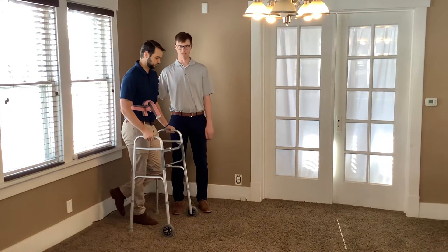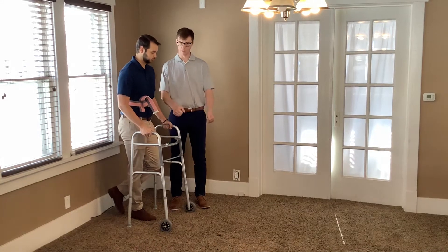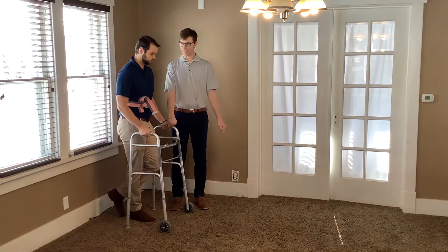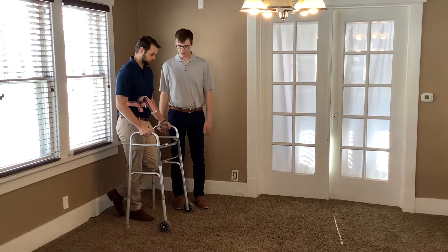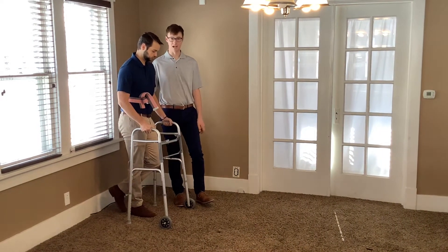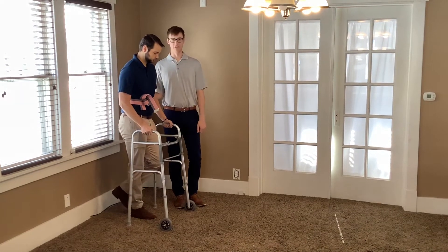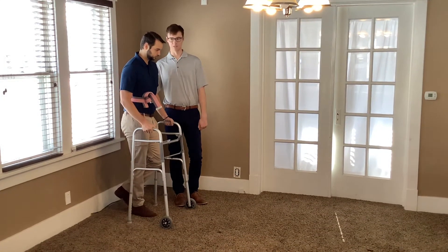Before we go, I'm going to give the instructions: roll the walker forward, push your weight through your hands and onto those hand rests, then move the affected leg forward. It is three-point gait so it is non-weight bearing — no weight through the leg, all through the hands — and then follow through with the unaffected leg, which is his right leg.